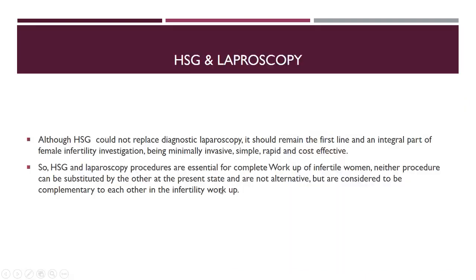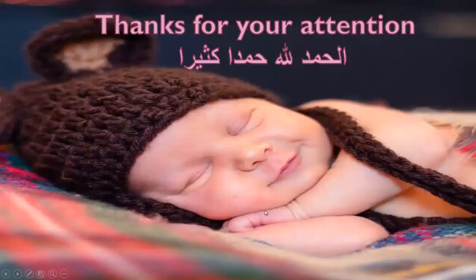So hysterosalpingography and laparoscopy are complementary to each other and not competitive. Hysterosalpingography could not replace diagnostic laparoscopy, but it is the first line and an integral part of the female infertility investigation. It is usually minimally invasive, rapid, and cost-effective. So they are completing each other, and the gold standard is the laparoscopy, of course. Thank you for your attention.